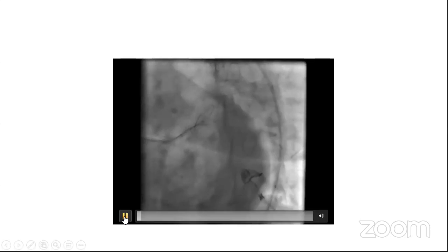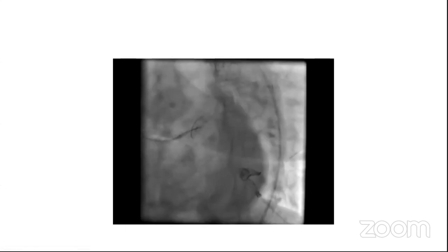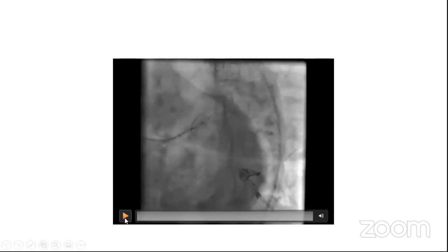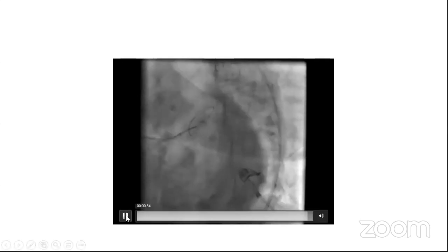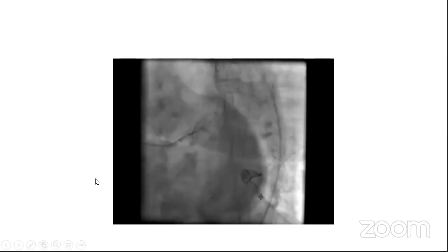Yes, Dr. Zahran, I think POT will make it easier. But as long as you said the patient is sweating with significant chest pain, and hemodynamics started to decline, I think I would try first to pass the wire into the circumflex and open the carina to the left circumflex before doing the POT. Yes, what I did is like what Dr. Ahmed Saeed and Dr. Haytham advised me to do.